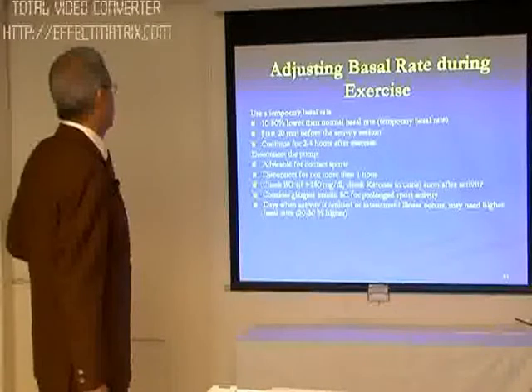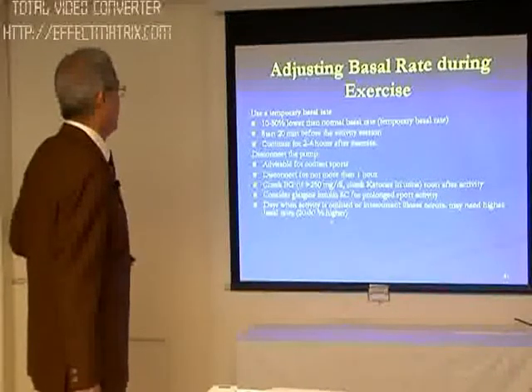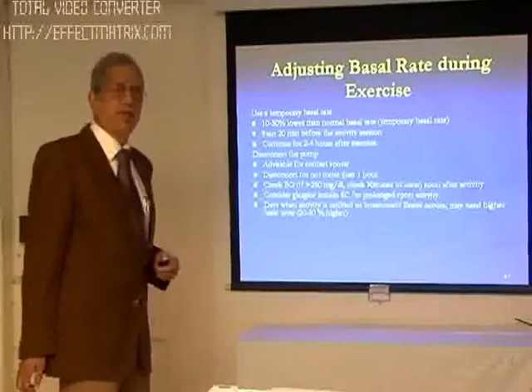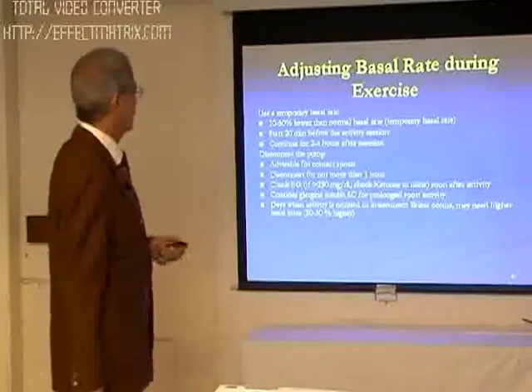On the day when activity is omitted, or there is an intercurrent illness like cold, cough, fever, the patient may need even a higher basal rate. And of course, on those days the exercise also does not occur, so the patient has to be aware of this kind of daily adjustments.